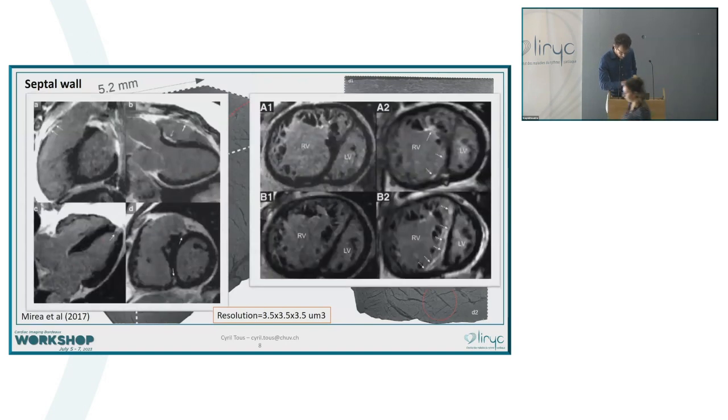The other spots you might see in some of the imaging are also because of the way they do the procedure. There is a reloading, a reconfiguration or remodeling of the loads onto some specific segments that are not designed to cope with this new demand.